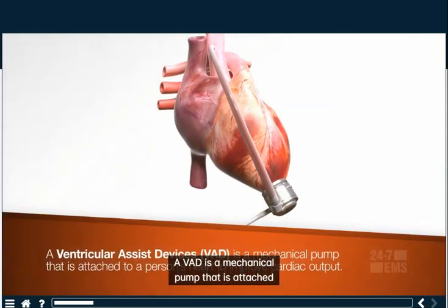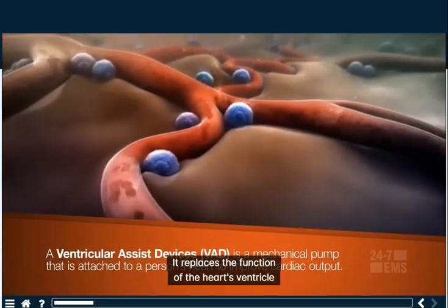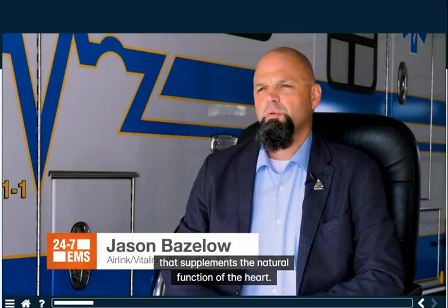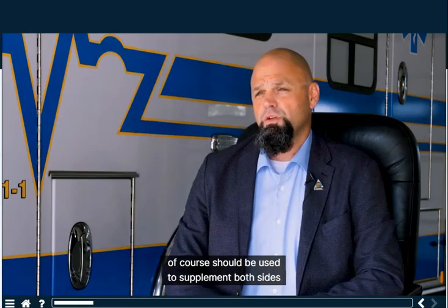A VAD is a mechanical pump that is attached to a person's heart to improve cardiac output. It replaces the function of the heart's ventricle to circulate blood through the heart and to the rest of the body. A ventricular assist device is a continuous flow device that supplements the natural function of the heart. It's typically used for the left ventricle, but occasionally the right. And in rare instances, it can also be used to supplement both sides of the heart.